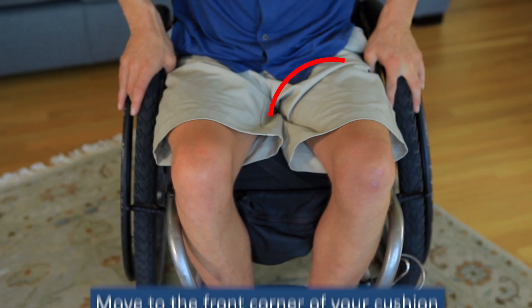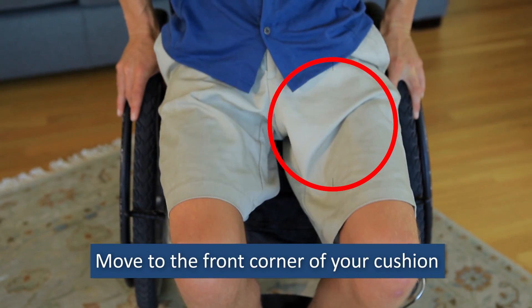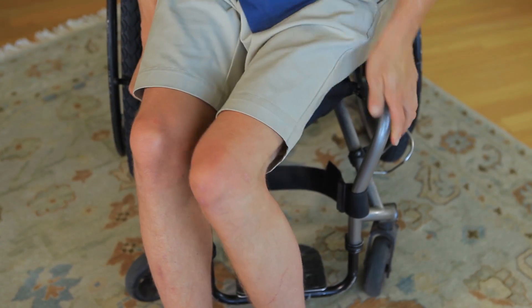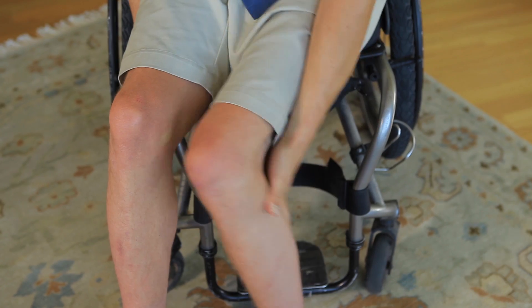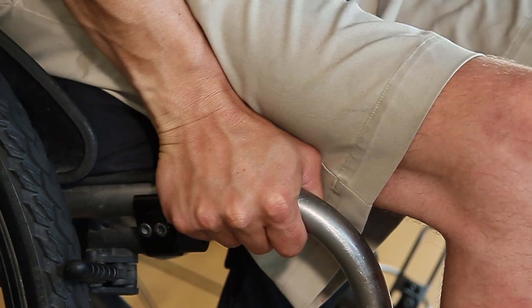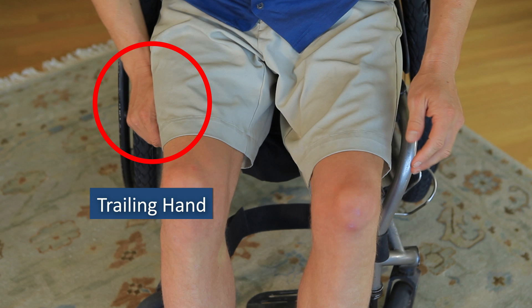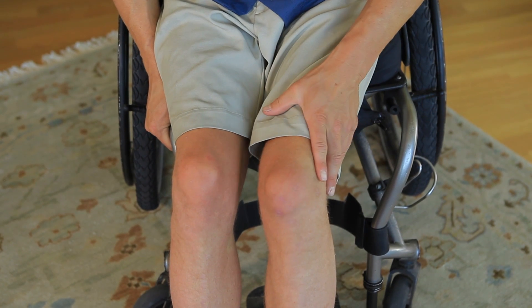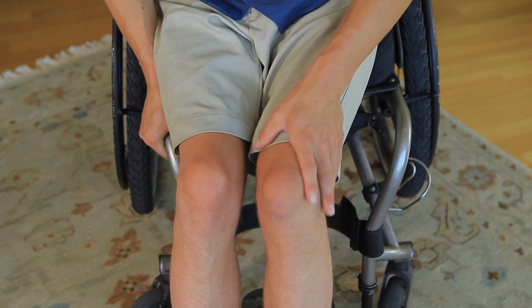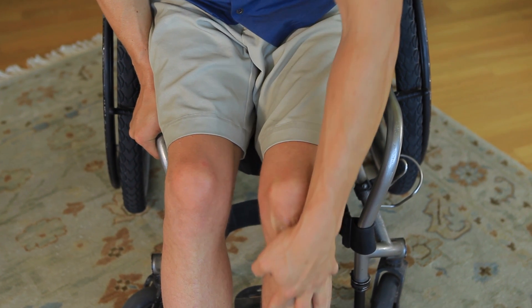Lock your wheel brakes and scoot to a front corner of your seat. You'll be getting out of your wheelchair at an angle, so set your feet on the floor off towards the side. Grasp the front of your frame with your trailing hand. Stabilize with your leading hand on your knee, sliding the hand down your leg to the floor as you bend forward at the waist.